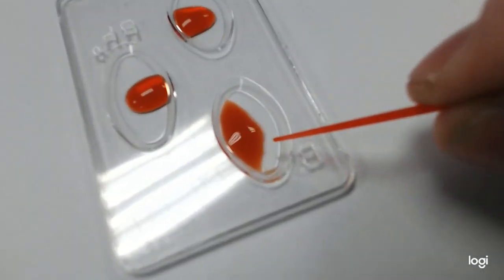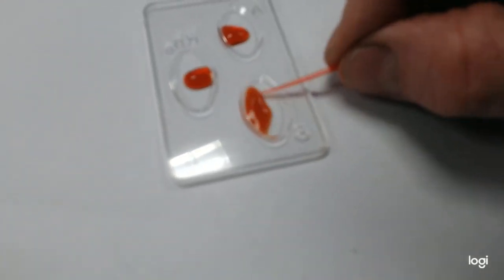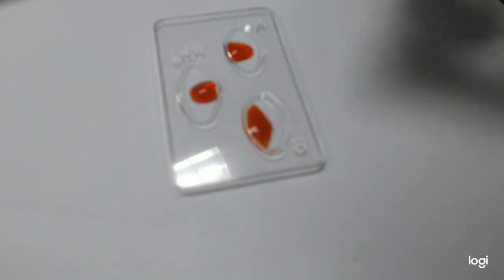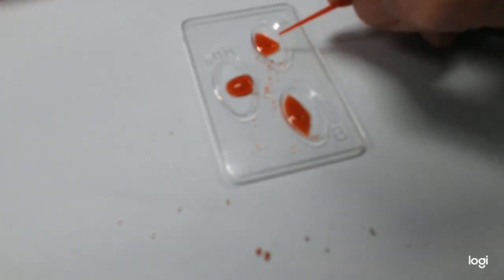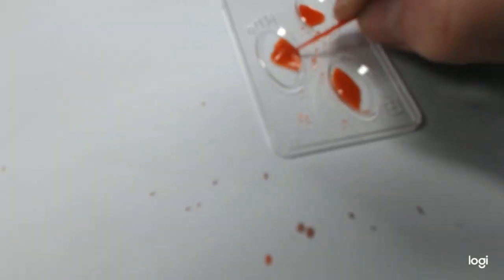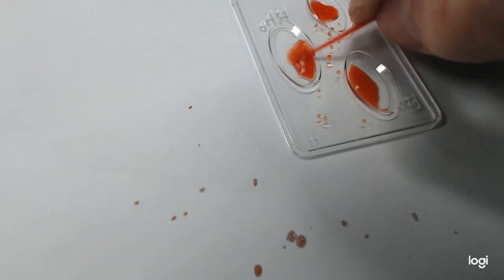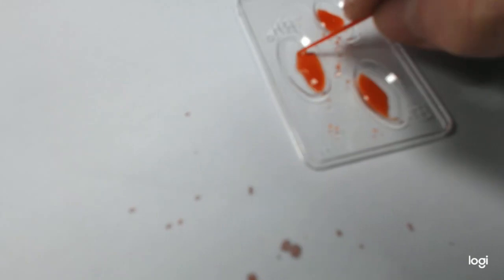Now this one is definitely blobbing up. This one, this time, the B is definitely getting thick and cloudy. Let's see about A. Anything happening with A? I didn't mean to splash it everywhere. Those are bubbles. Okay, and the RH is clouded up.